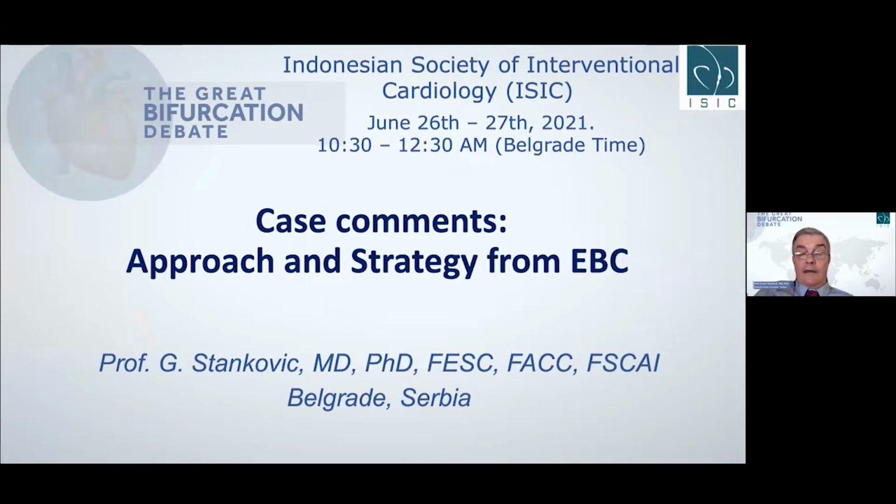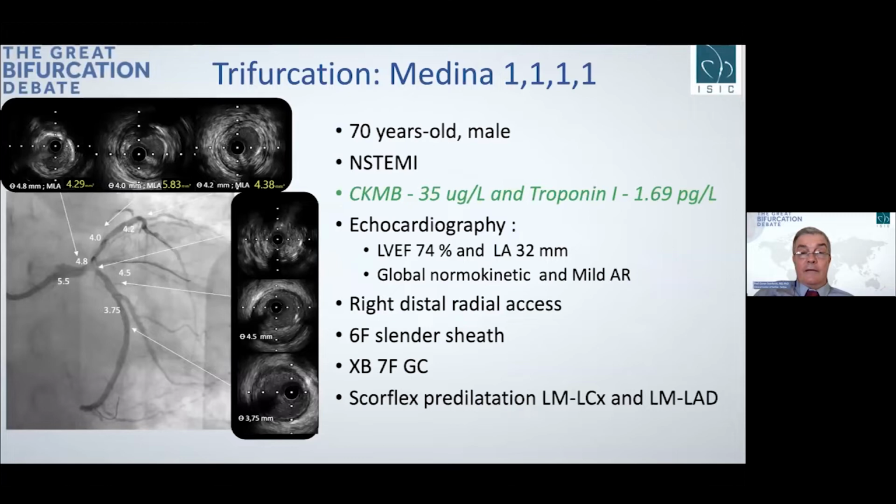Yes. Okay. So I will start with a summary, just to mention that it was non-STEMI with positive lab documentation, and by echo it was normokinetic. And I really respect very much the first part of the procedure, which was presented by Dr. Munawar, since I believe this was the most difficult part, to be honest, in my interpretation, since he really was able to wire all the vessels, which is, I think, in this complex anatomy, extremely difficult.